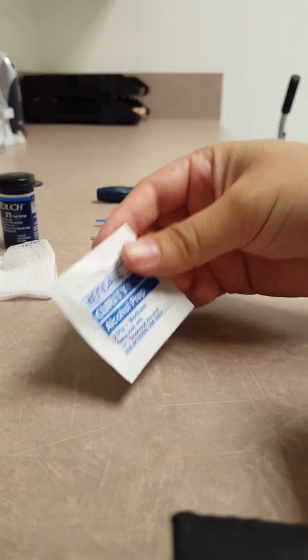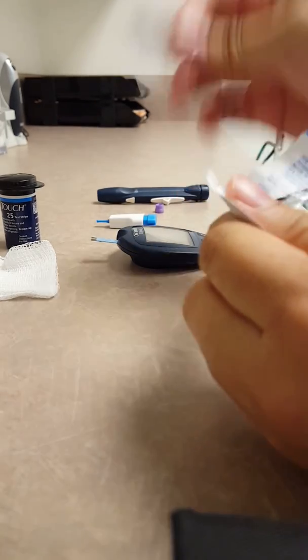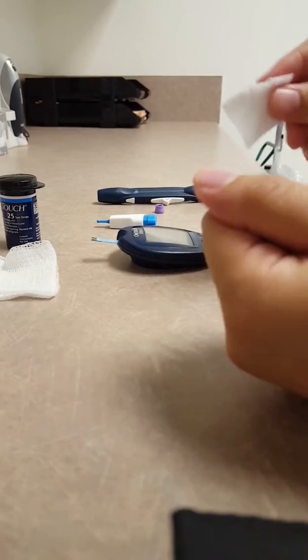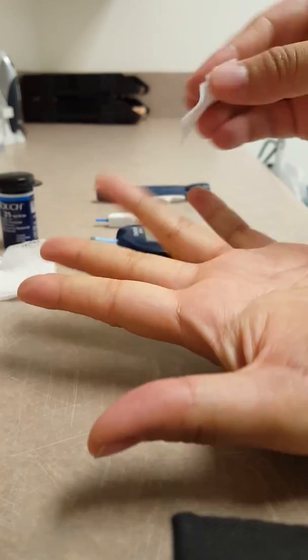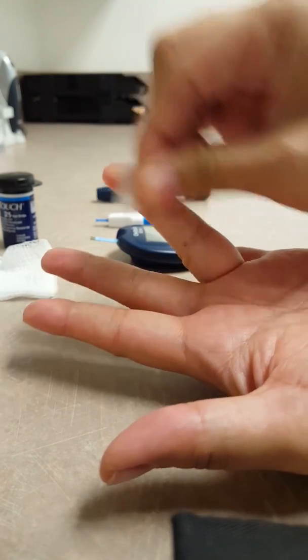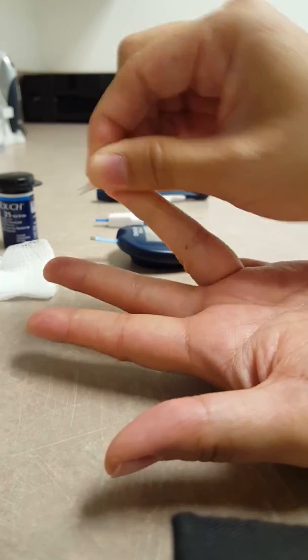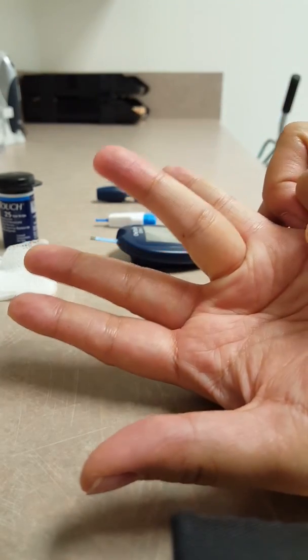So what we're going to do is let's open up our alcohol wipe. We are going to clean the finger that you're going to use with the alcohol — this is going to help disinfect it. A really important part here is that you let the alcohol fully dry.